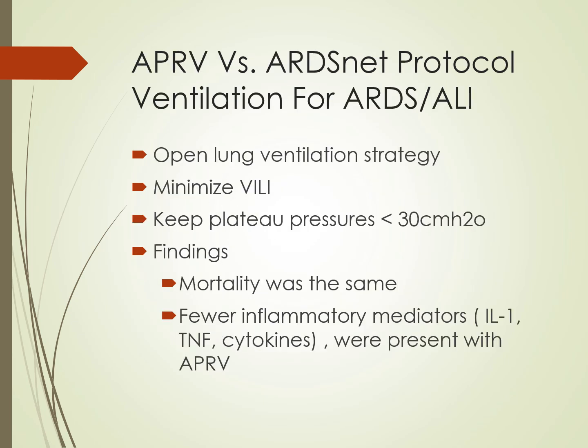I wanted to tell you a little bit about some studies that were done with the use of APRV. They actually did a study of APRV versus the ARDSnet protocol, and this is for patients with ARDS. Both of these strategies, APRV and ARDSnet, are open lung ventilation strategies. Both of them minimize ventilator-induced lung injury.